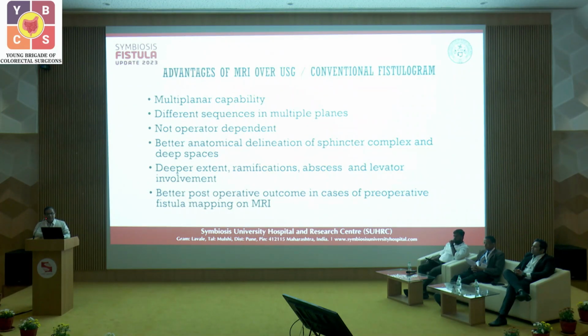The deeper extent, ramification, abscess, and levator ani involvement will be seen better with MR. It has been proven beyond doubt in the last 20 years that when you do surgery without preoperative MR and are not able to identify the deeper spaces correctly, you are likely to fail, and the patient will have a recurrence and come back to you. So it is always better to have a preoperative mapping of the fistula on MR.